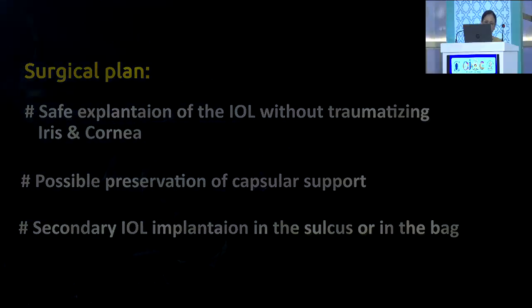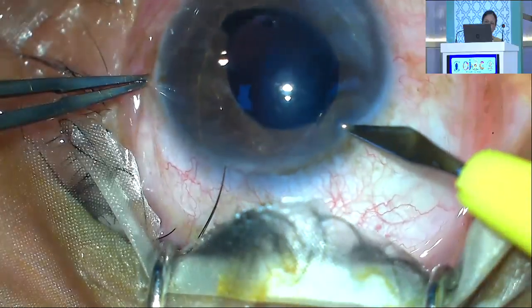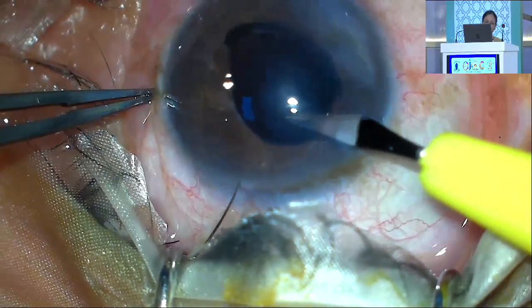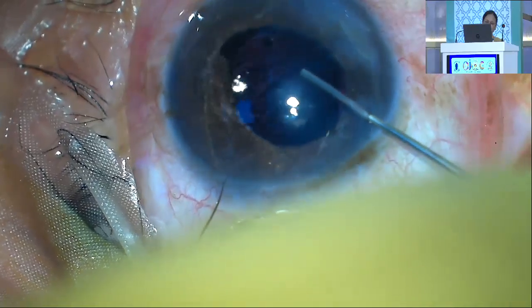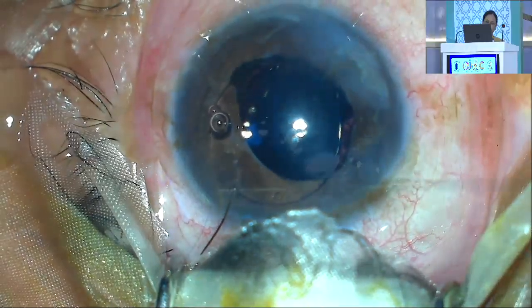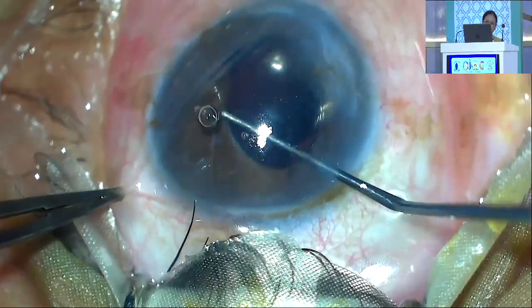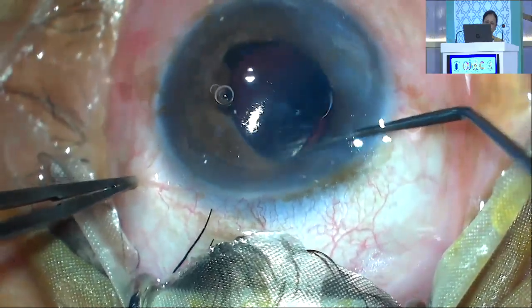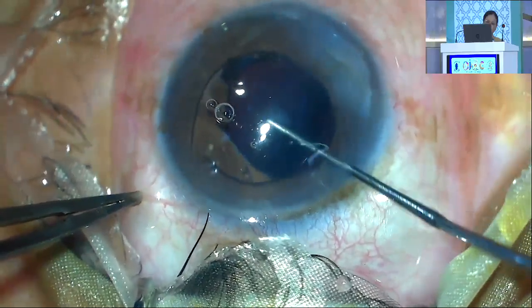Under peribulbar anesthesia, a side port was made at 10 o'clock position and dispersive along with cohesive viscoelastic were injected to protect the endothelium and to adequately deepen the anterior chamber. A dialing instrument was introduced at the superior optic-haptic junction of the PMMA IOL to dial it clockwise to make it free from the superior angle.